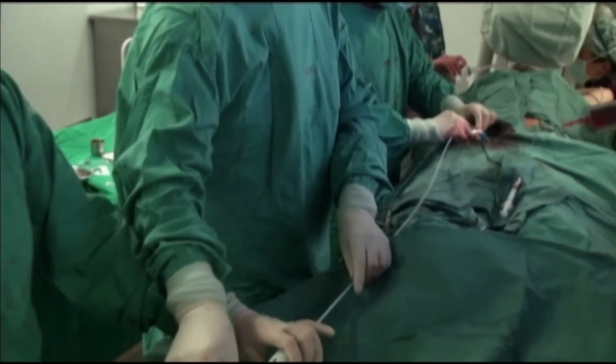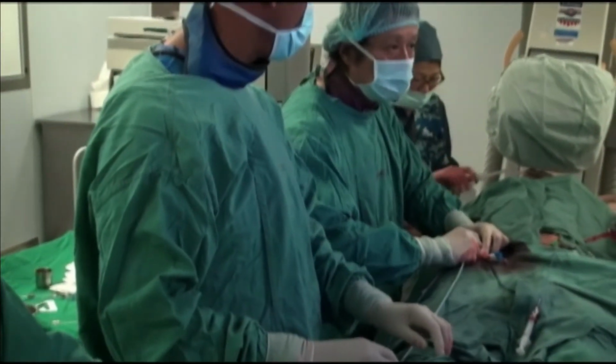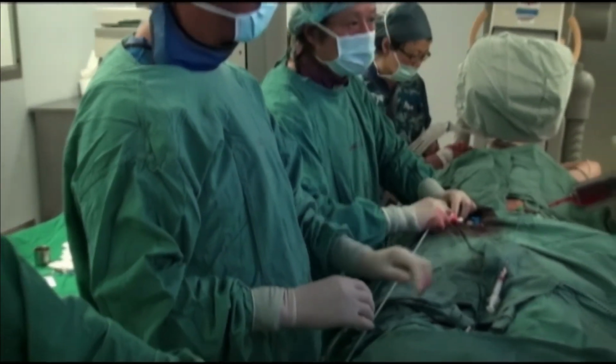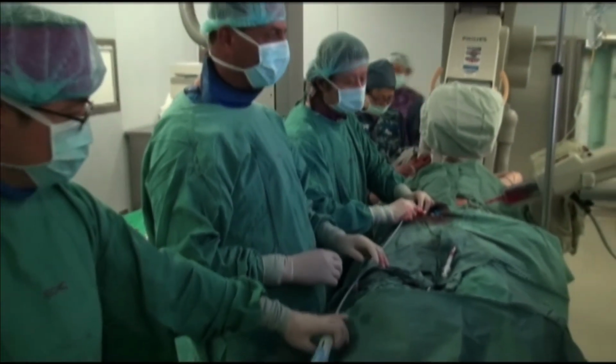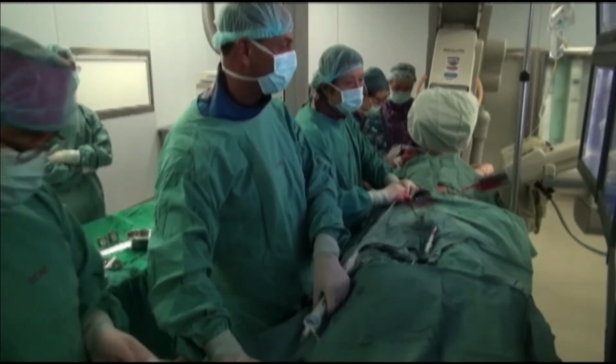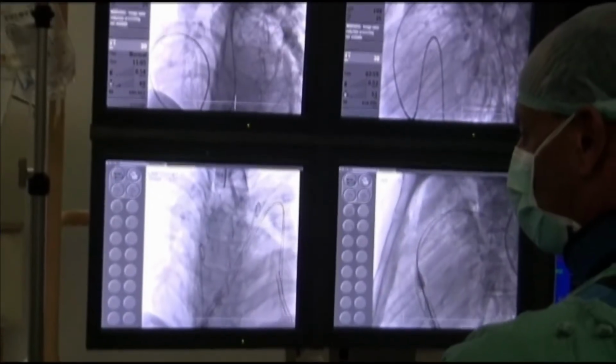Fix it. Push. Push. Not much resistance with the sheath, so we're going there. Keep going all the way. Just 1 second.